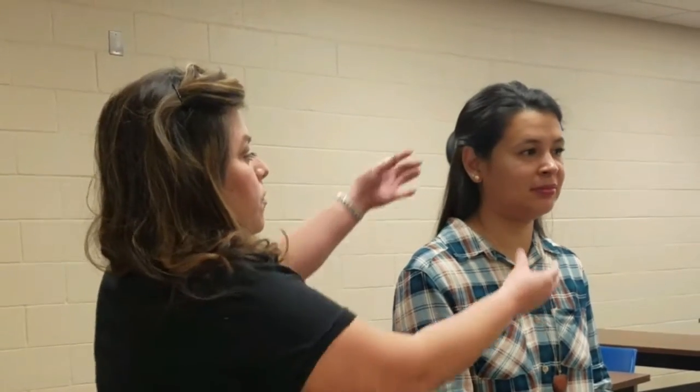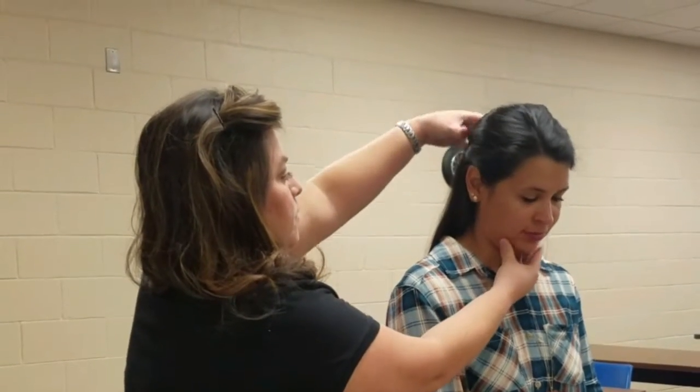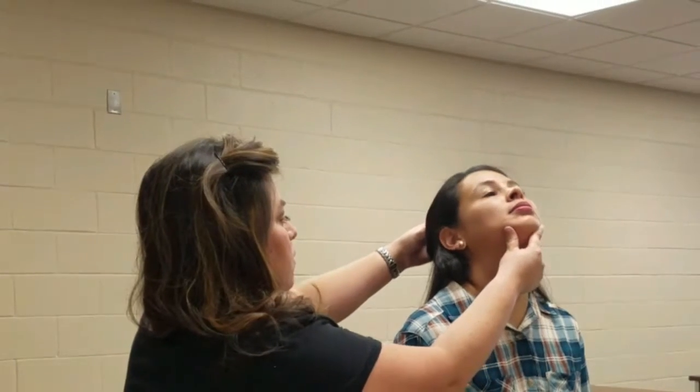I'm a student physical therapist assistant, and today I'm going to be performing some goniometric measurements of the cervical spine. The first measurements we're going to take are of cervical flexion and extension. We need our patient sitting upright and sitting straight, looking straight ahead.